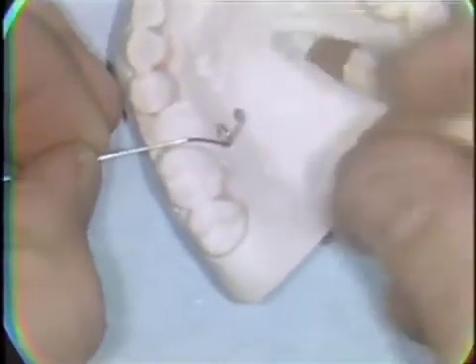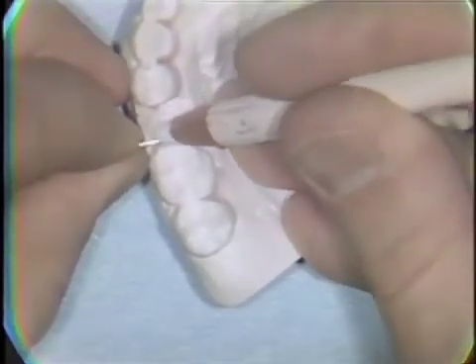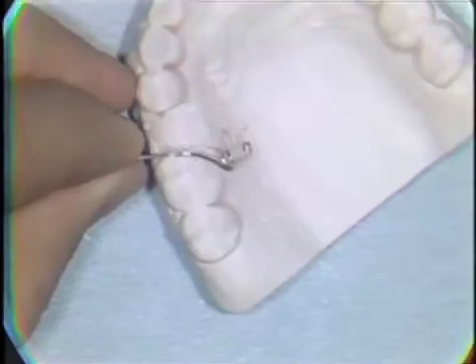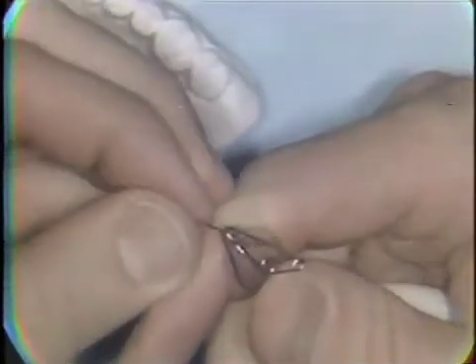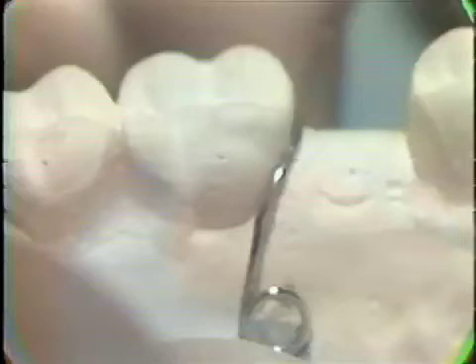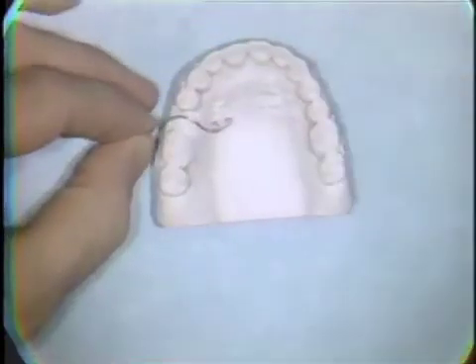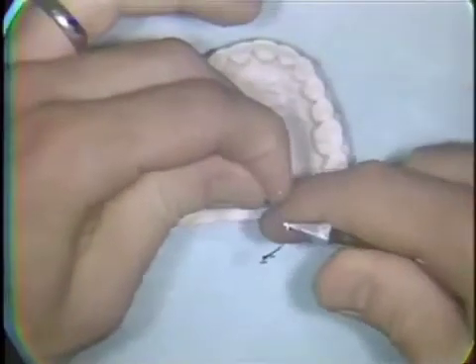It's necessary to make a pencil mark on the wire frequently to indicate the spot where the next bend should be made. The wire should fully contact the mesial surface of the molar tooth. You continue to adapt the wire to extend around to the buccal of the tooth with a series of small bends.